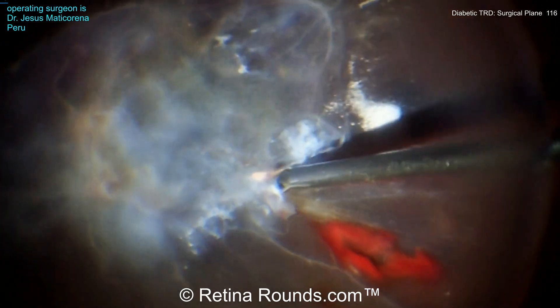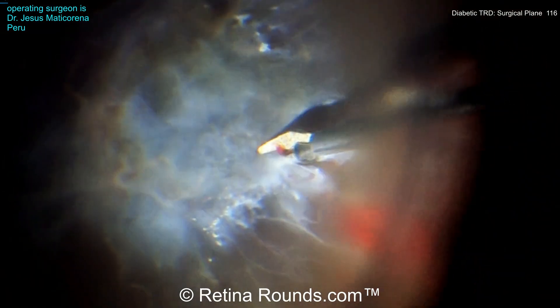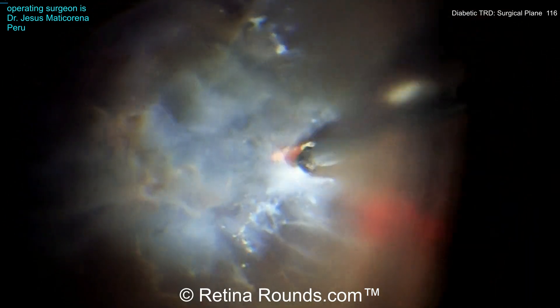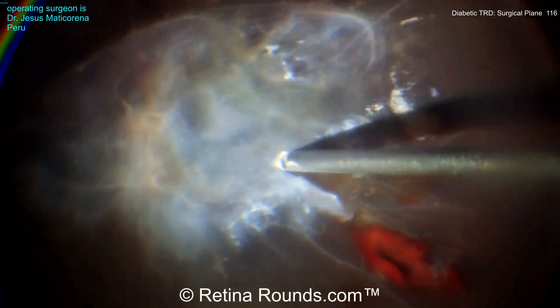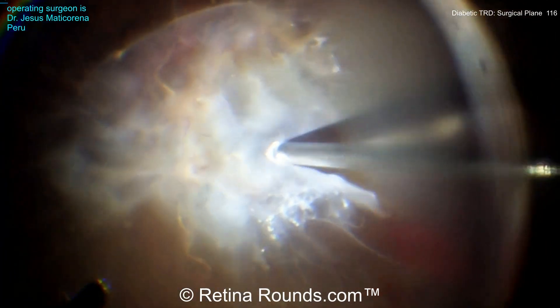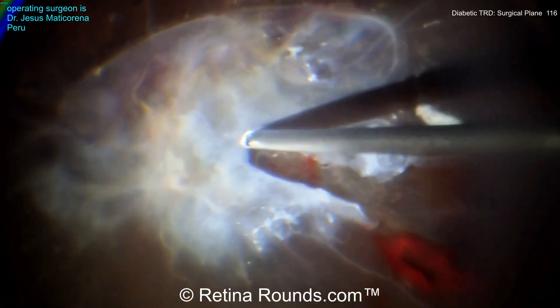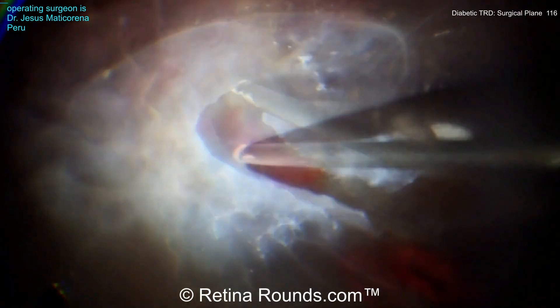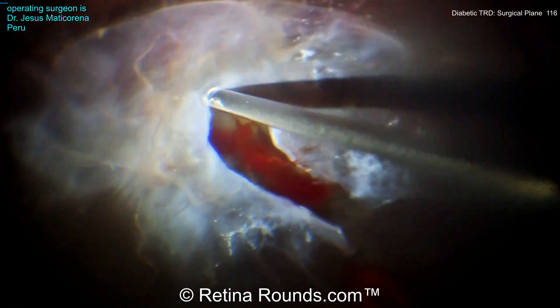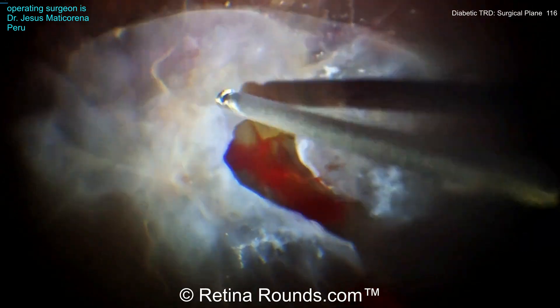Dr. Maticarena has gone to the supratemporal area where that subhyaloid hemorrhage appears to be, and he's trying to dissect into this area using horizontal scissors. Now that he's found the correct surgical plane between the posterior cortical vitreous, between this fibrosis and the underlying retina, he's using the vitreous cutter to carefully dissect through these areas of fibrosis.